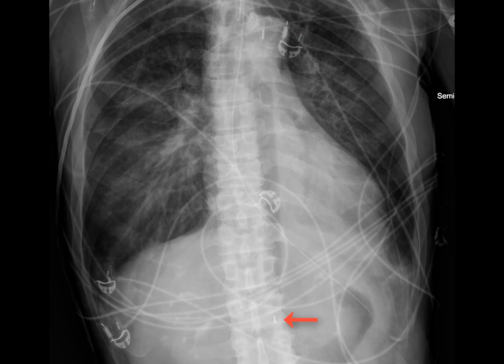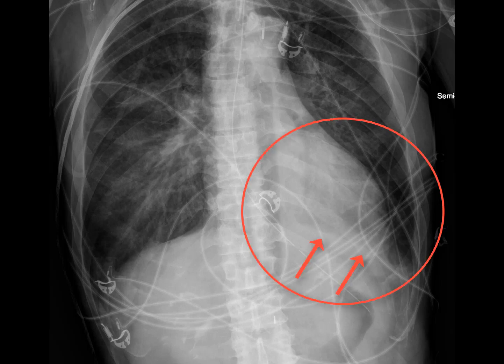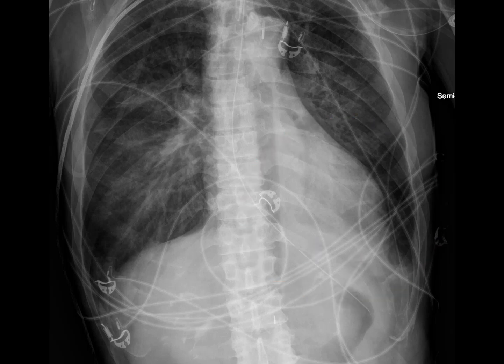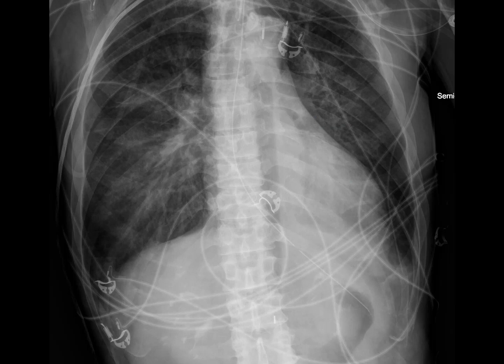The other marker is in the abdominal aorta at the level of L2. A few other things to take note of on this view: there is airspace opacity in the left lower lobe, with partial silhouetting of the left hemidiaphragm and complete silhouetting of the lateral border of the aorta, and we can see several air bronchograms. In addition, you'll notice retained contrast in the collecting system of both kidneys, presumably related to previous iodinated intravenous contrast administration in this person who presumably has decreased renal function.